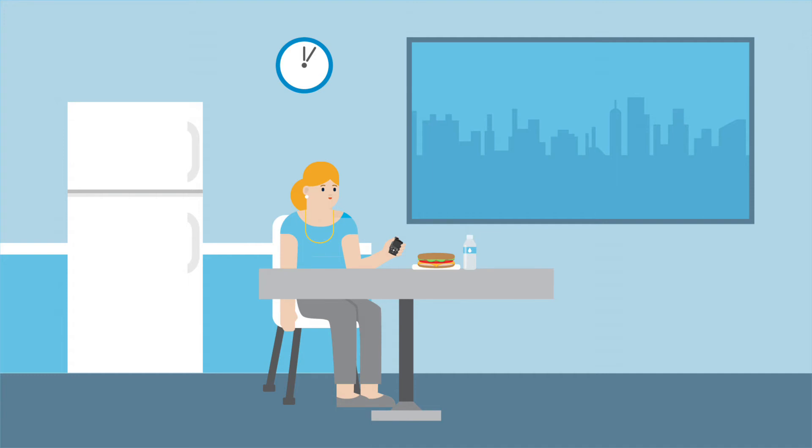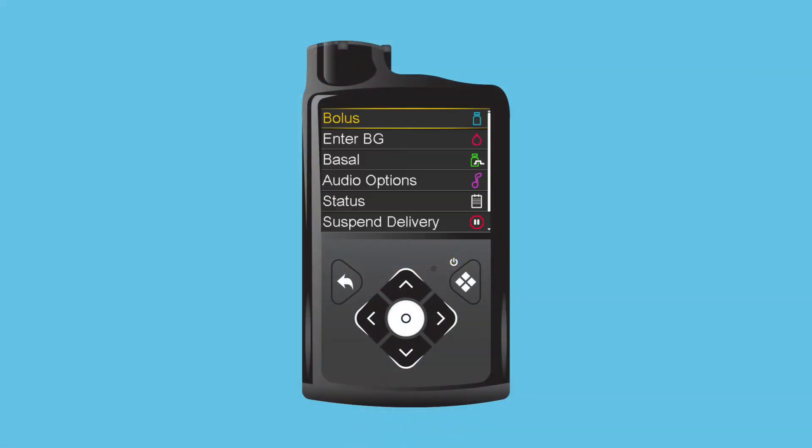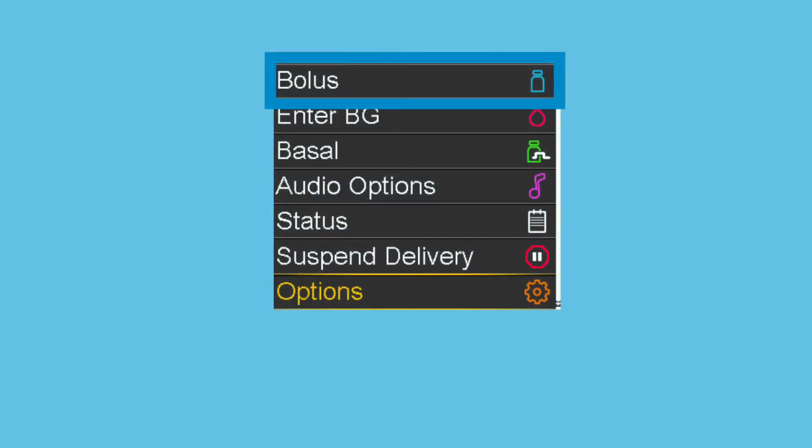Now that she is getting the hang of the pump buttons, Clara decides to look over the menu. She presses the Select button to open it. The first thing she sees is a list of the first six menu items. She notices a scroll bar to the far right of the screen and pushes the down arrow to see the last option. Bolus, the first option, gives access to the Bolus Wizard, Manual Bolus, or Preset Bolus option.